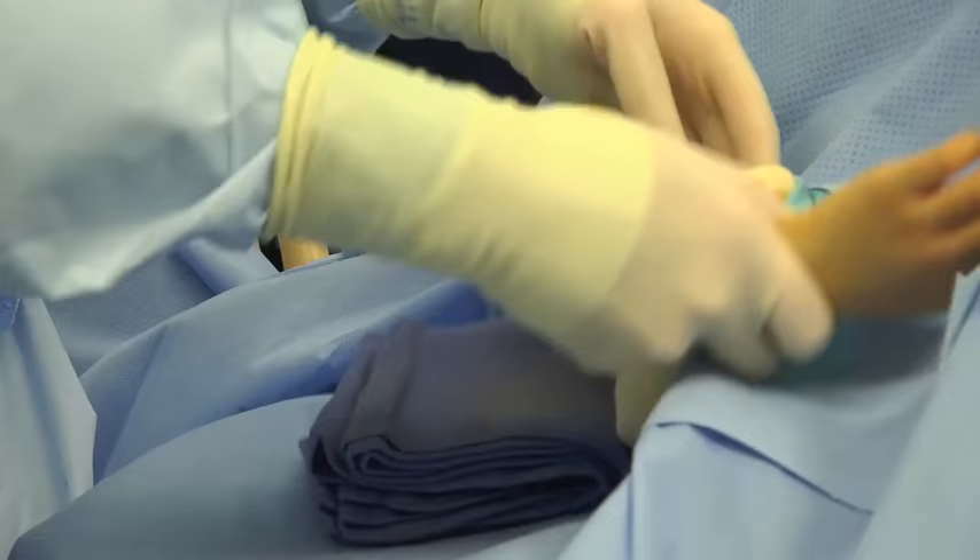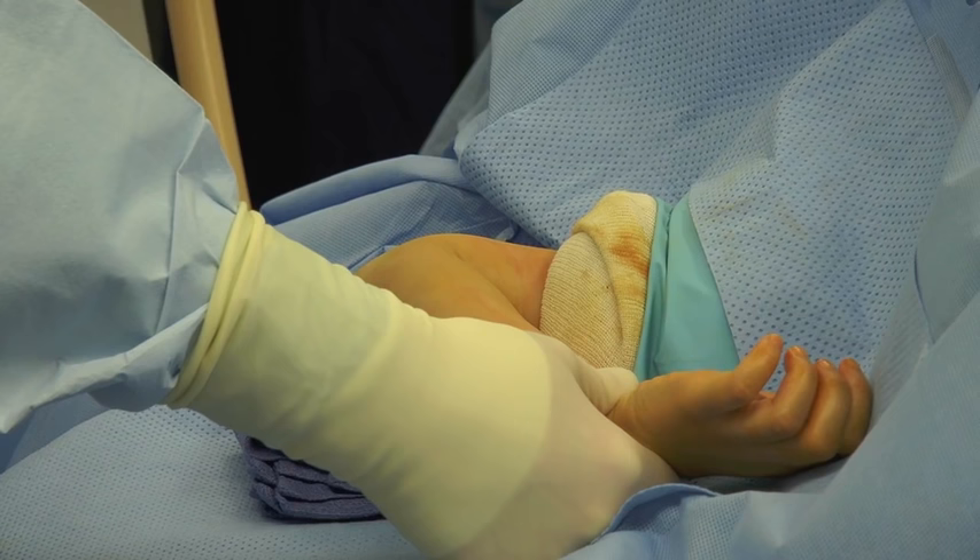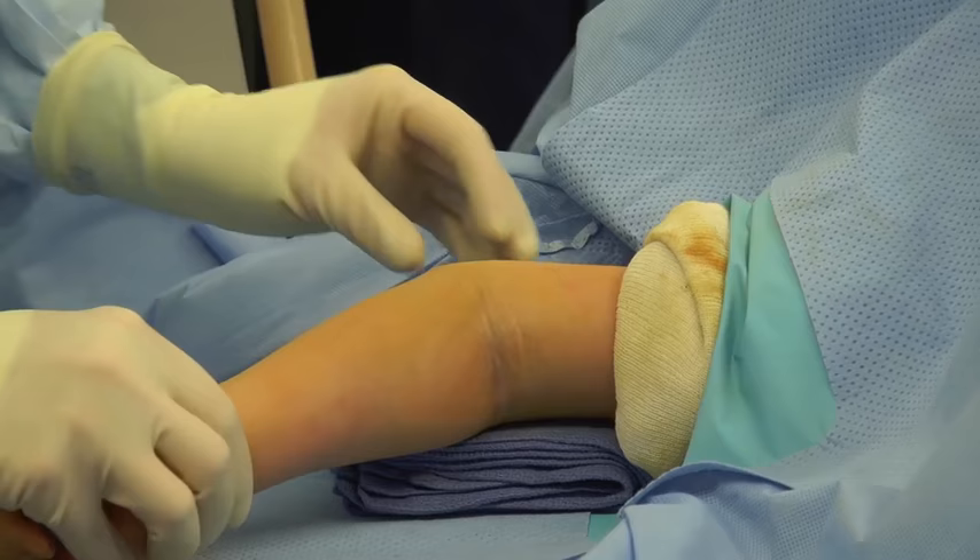Once the final position of the pins in the lateral projection has been checked on fluoroscopy, dynamic screening can also occur. In order for this to occur, the elbow is brought out into extension and again a lateral picture is taken. There should be no fracture site motion.